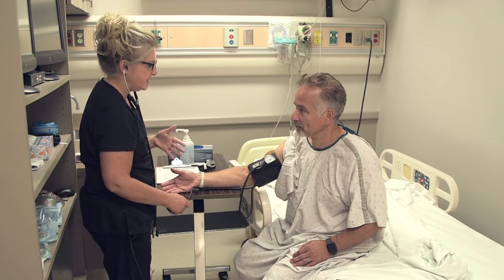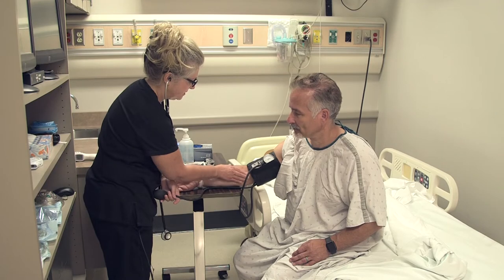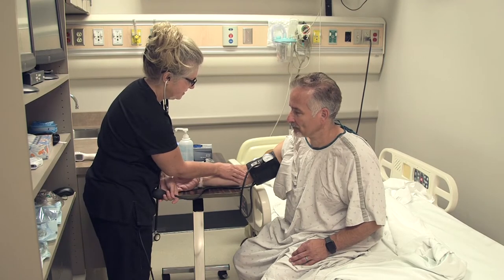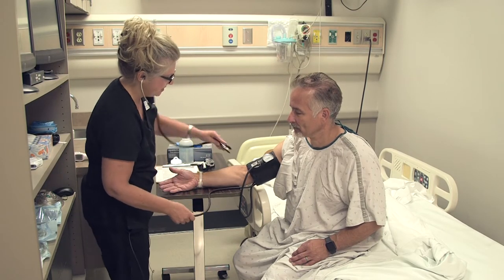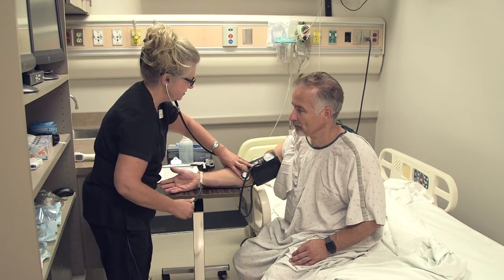So we're just going to pretend that I waited 2 to 3 minutes. And I'm going to go ahead and check it. So now I'm going to find where his brachial pulse is, which is right there. Put this right there. And I'm going to go ahead and check your blood pressure now for sure.